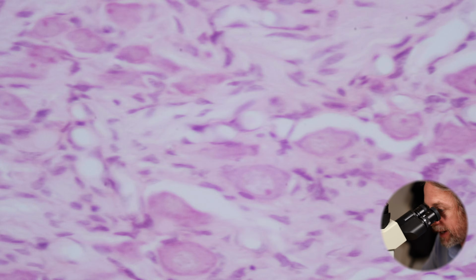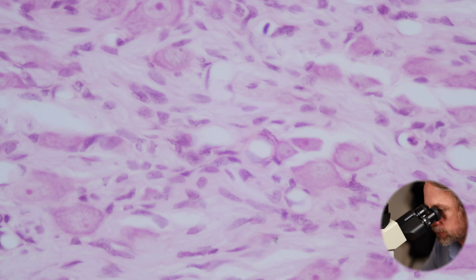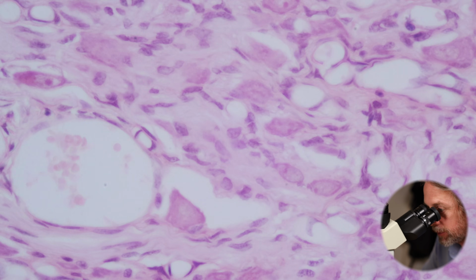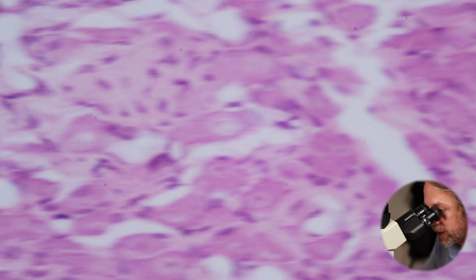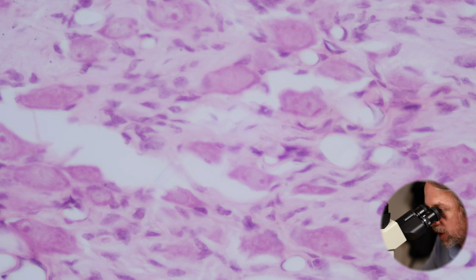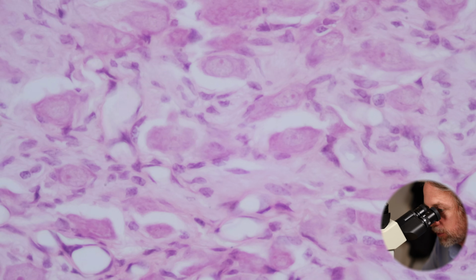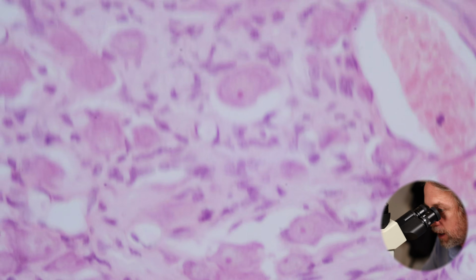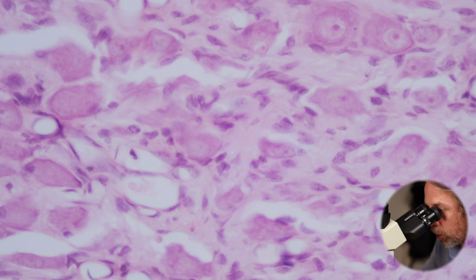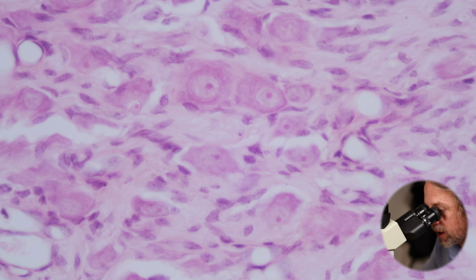But this is why we see those bulges. This is why we see ganglia throughout the body. The dorsal root ganglion, they're a little bit special, but most sensory neurons, their cell bodies will be found outside the central nervous system as a little bit of a bump. And that's why we've got a little bit of a bump, because we've got these cell bodies packed together, and you add up all those cell bodies, you get a little bit of a lump. It's bigger than the axons. The axons are tiny. They're tiny processes extending from here. But this is what a sympathetic ganglion looks like inside.